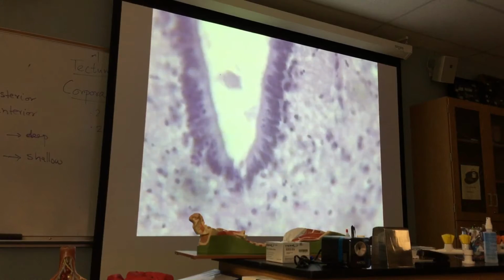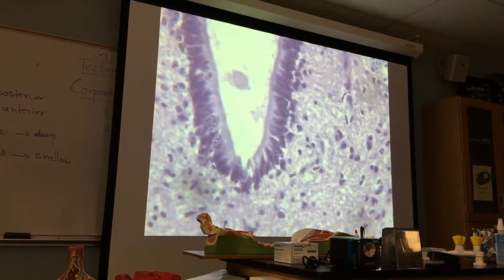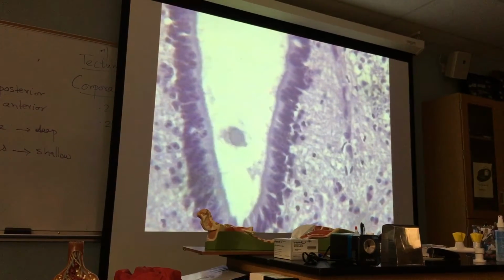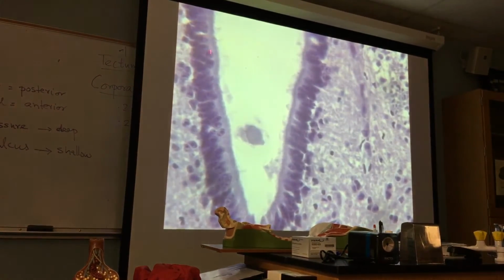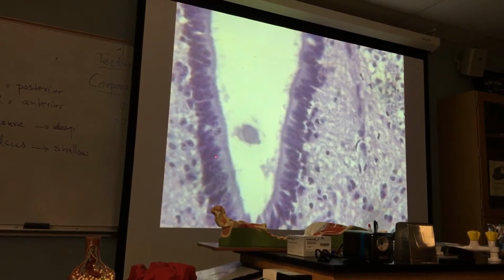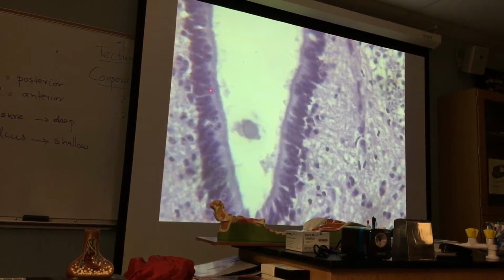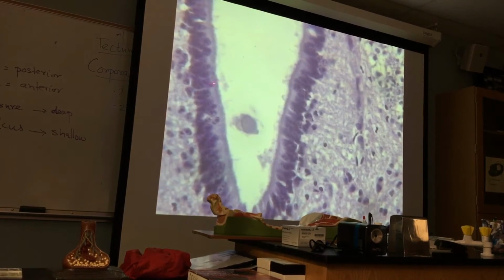Under higher magnification, you can see even more. Look at them. These cells are ciliated cells. You see the cilia? Simple columnar epithelium. And these cells are called ependymal cells. If I ask you what is the function of the cell as indicated, it secretes CSF and circulates it.